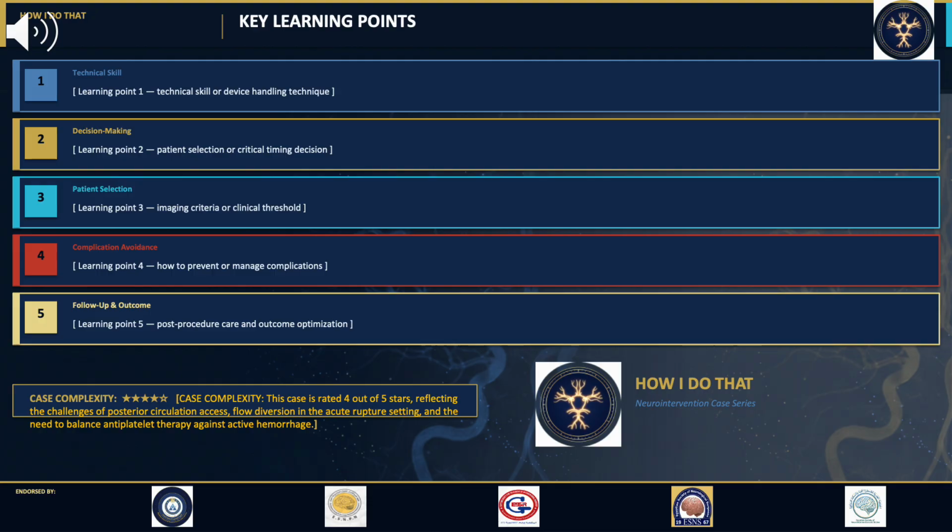was selected for device delivery. The flow diverter deployed was a Pipeline Flex with Shield technology, size 2.50 x 14. Navigating a microcatheter through the posterior circulation to the PICA origin demands precise catheter control.